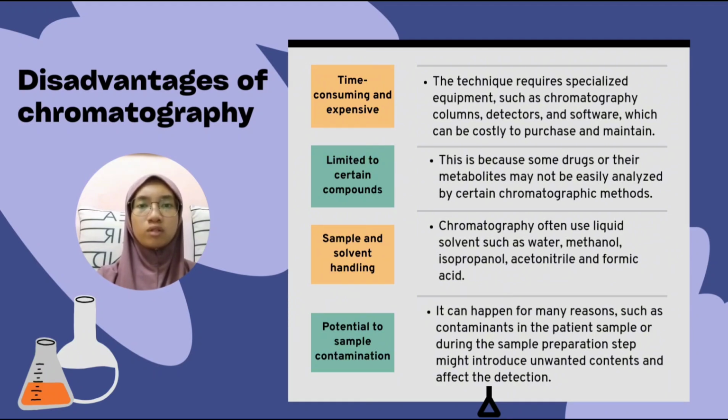Furthermore, the presence of moisture or air bubbles in the samples might alter the retention time. Other than that, sample degradation after preparation and exposure to light, improper storage, handling or extraction can alter the composition of analytes, affecting separation.